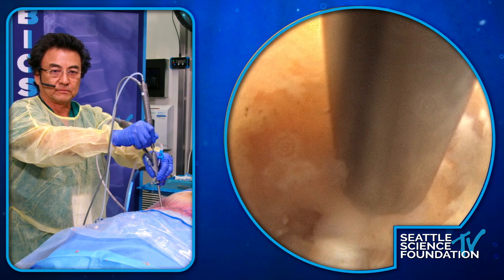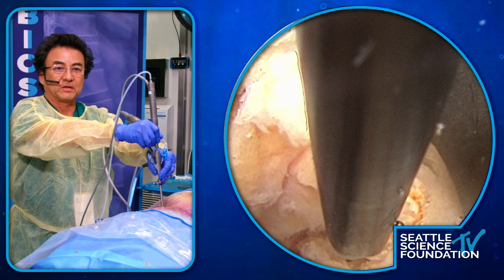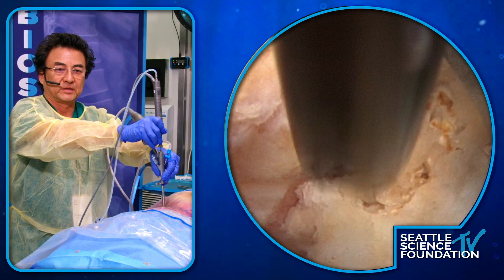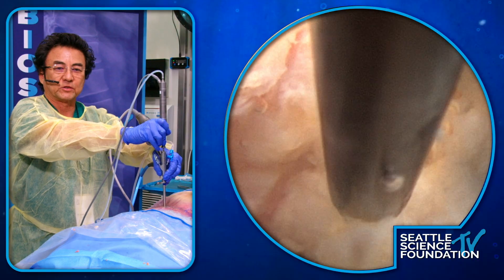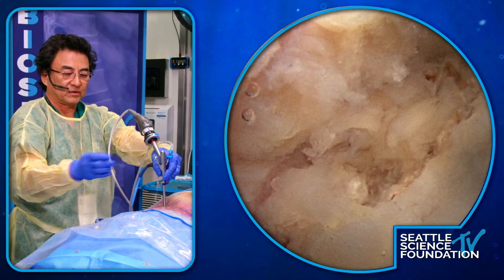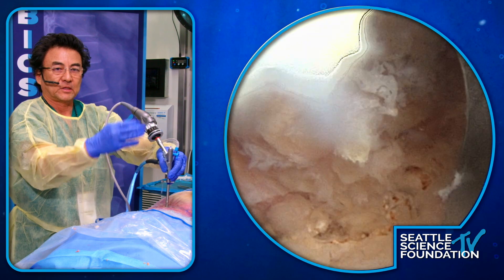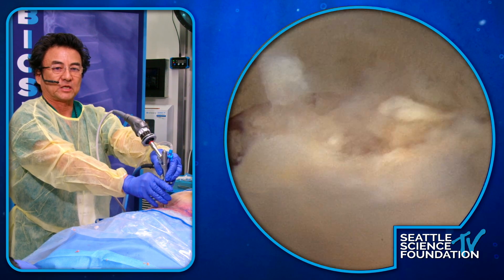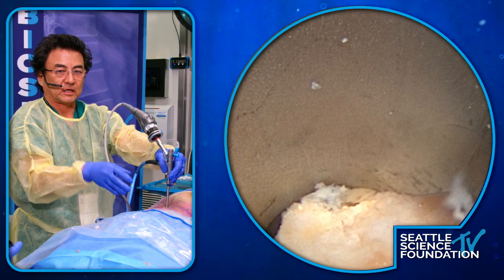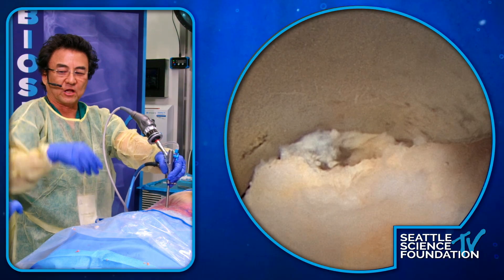Can you show us outside the cadaver how the tip looks so we can understand how this works? It's a circle — a little tube that's hollow in the middle — so it almost works like a burr. There's also a blade attachment; it looks like the end of a butter knife. A lot of people want to make a really sharp cut, but I personally like to make little circular resections.